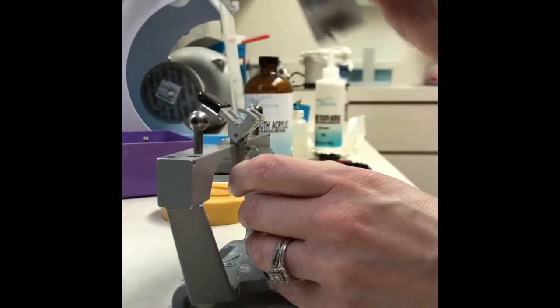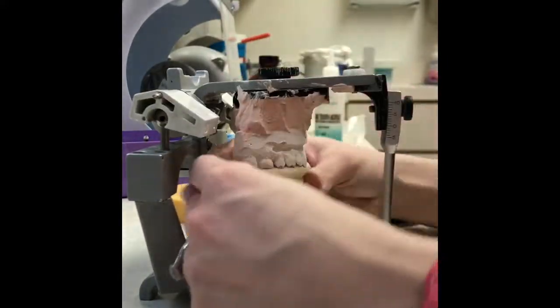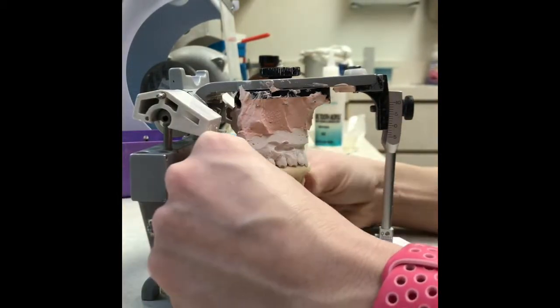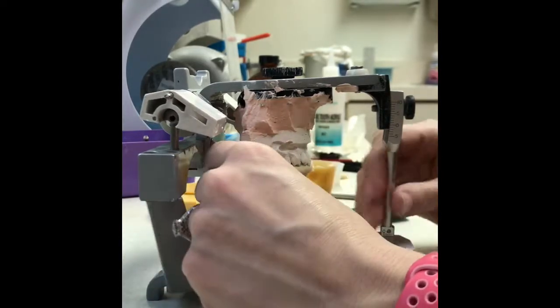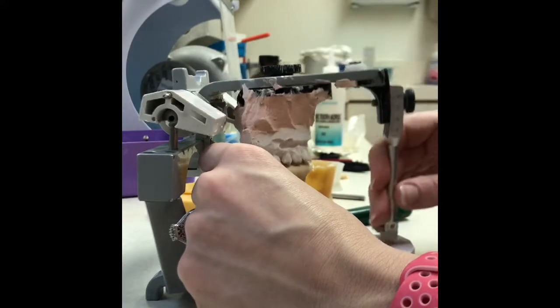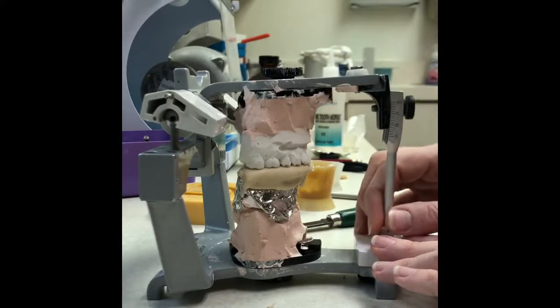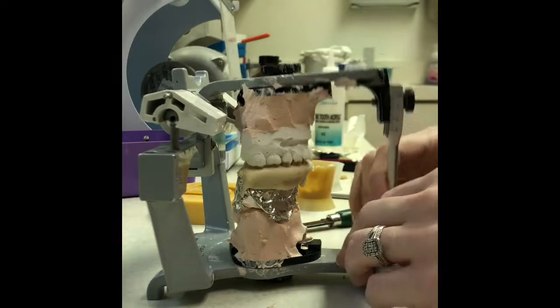As it sets up, it gets really warm, and that's how we know that the monomer and the polymer are acting together, because it starts to get warm. And then we wait. Every once in a while we'll just plane this to make sure that these teeth aren't getting stuck on the cast. Make sure that the stone's not getting stuck into the acrylic and getting attached there, but that's what the Vaseline's for. And we wait.